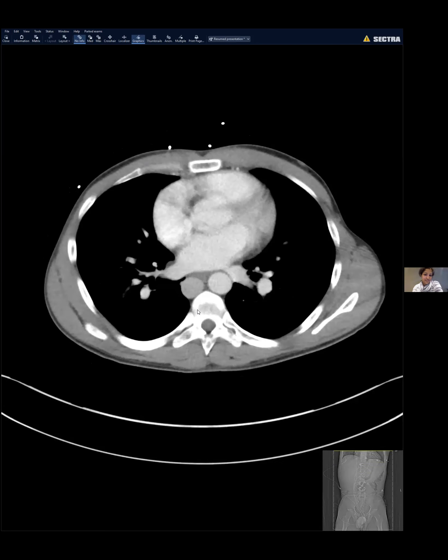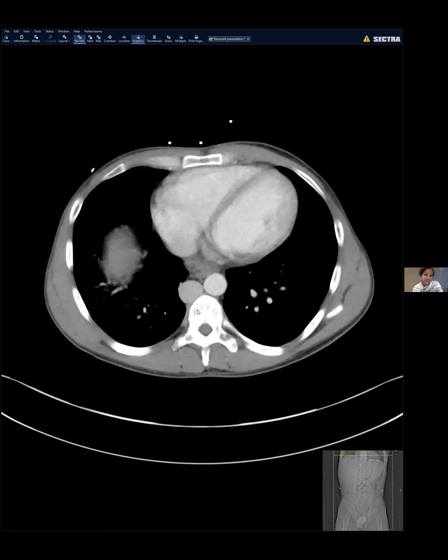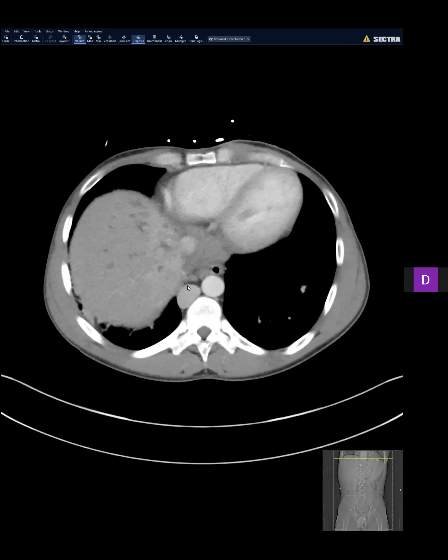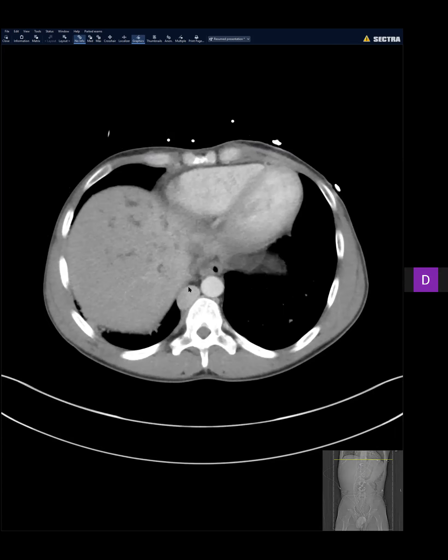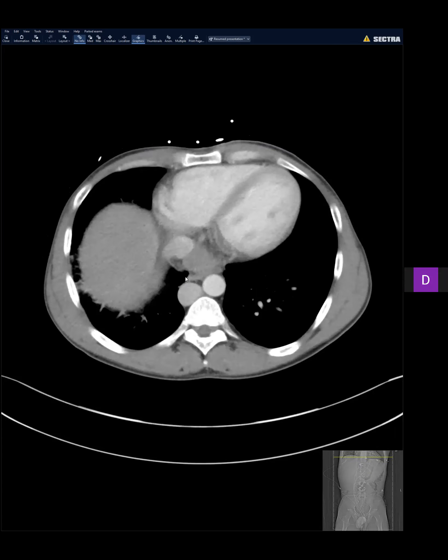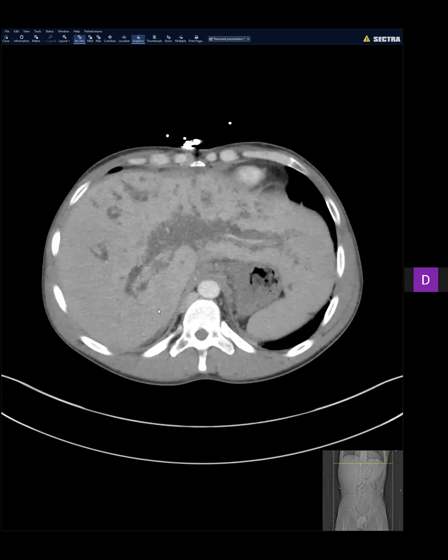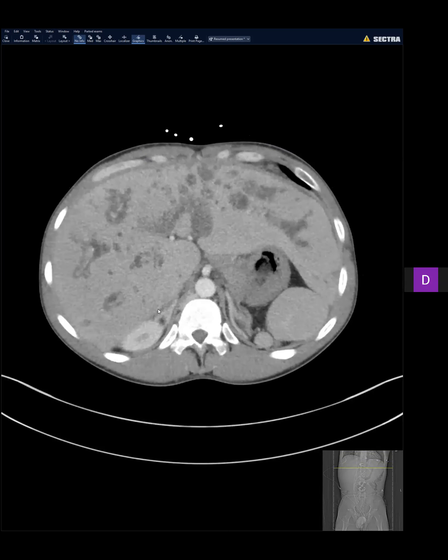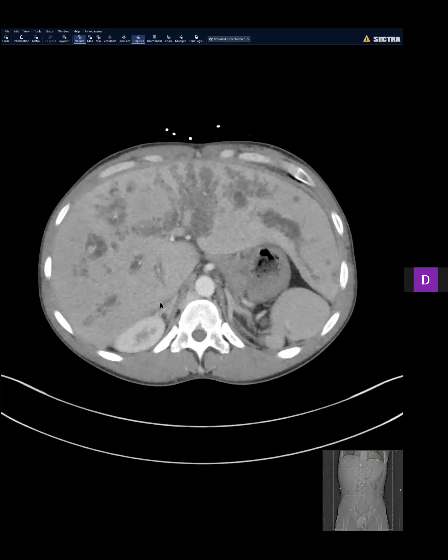There is azygous continuation of the IVC, peribiliary cysts, or cystic changes along the bile duct.